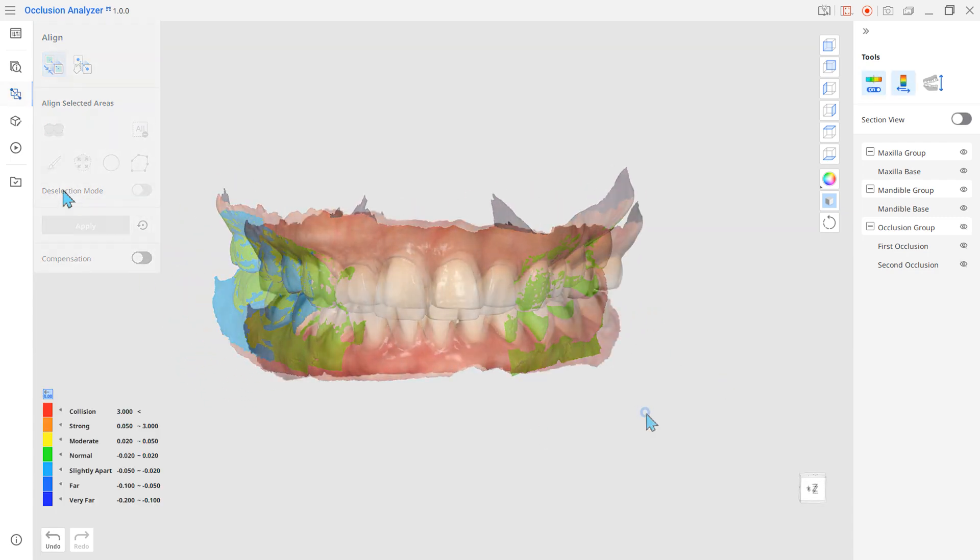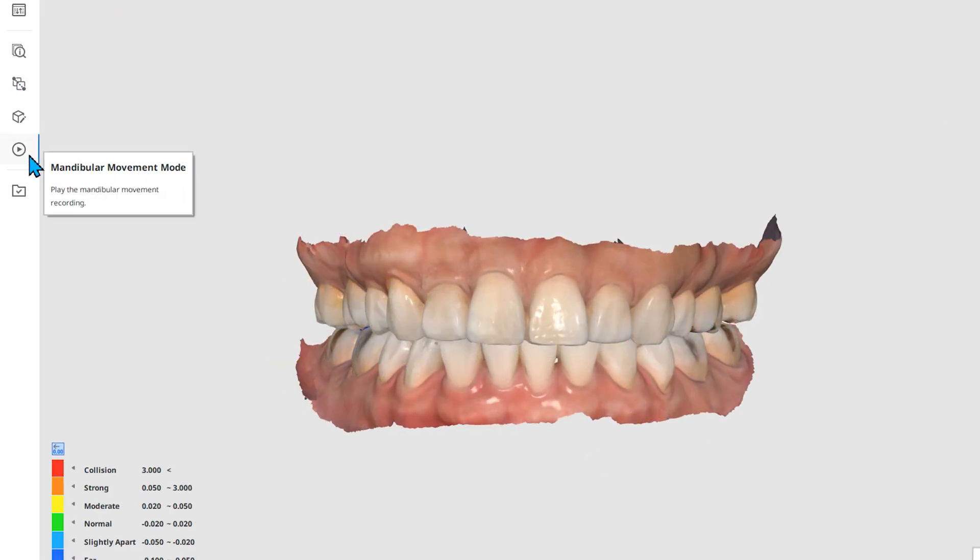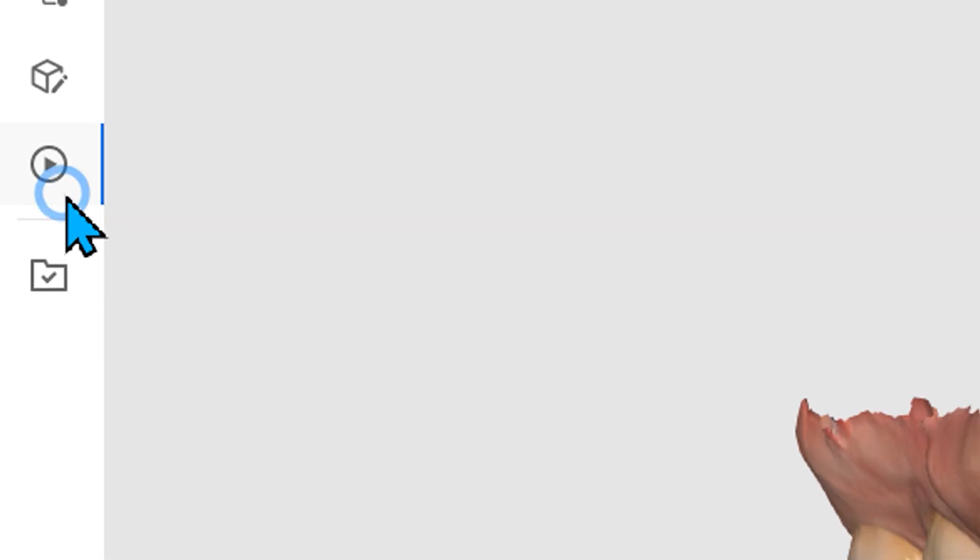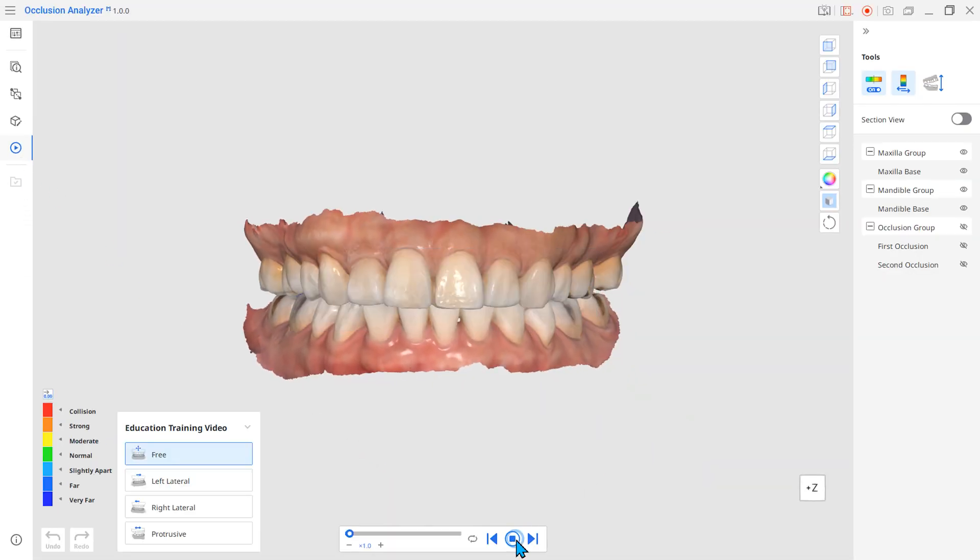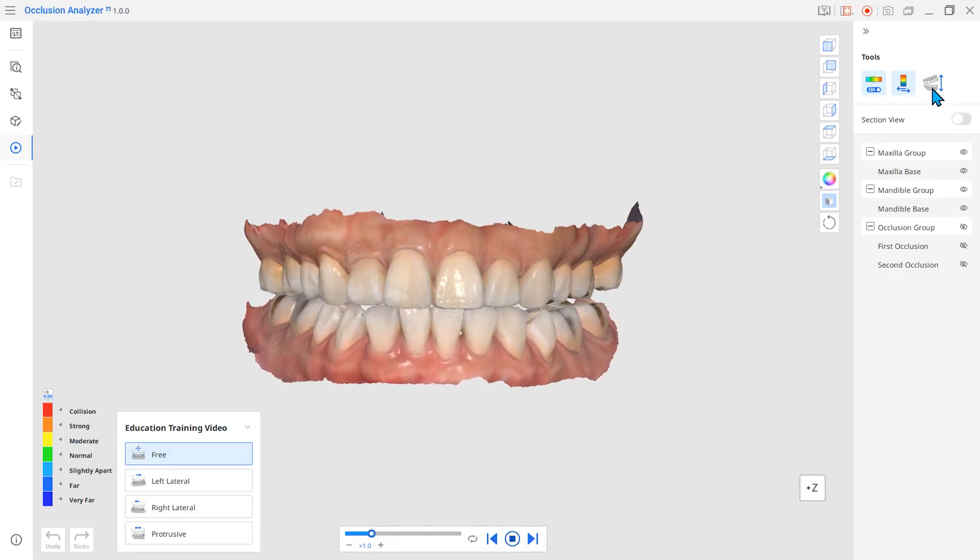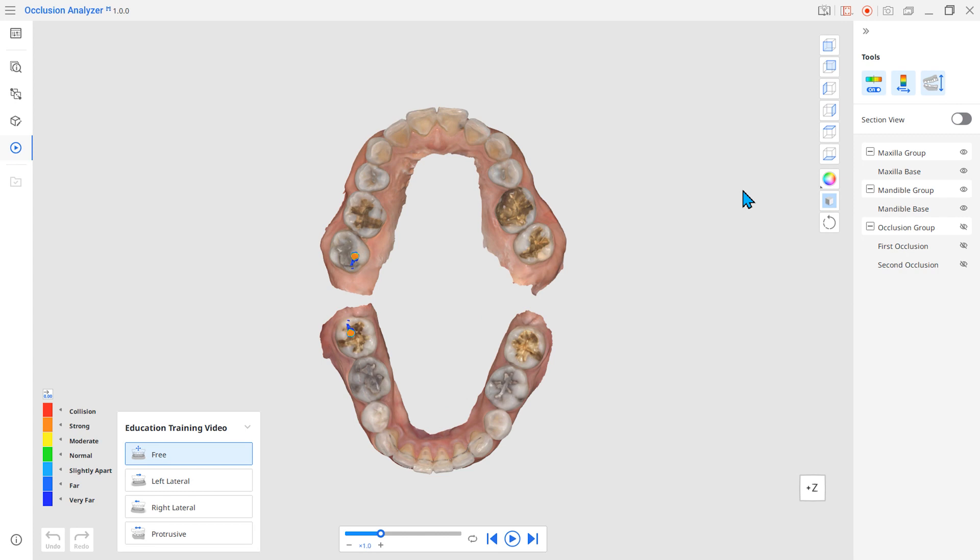Finally, you can easily check the contact areas by replaying the mandibular movement recordings that were previously captured in MeditScan for clinics.